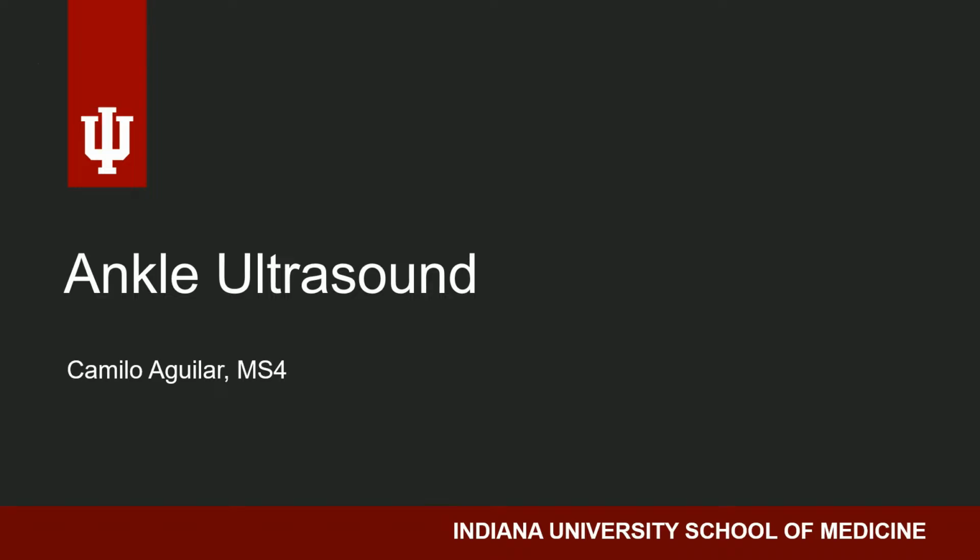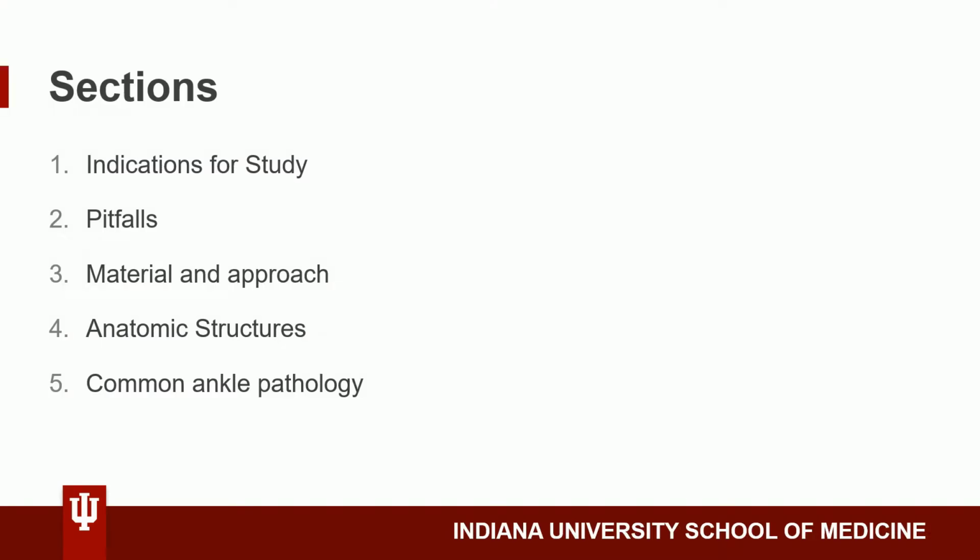In this presentation, we will be covering ankle ultrasounds. Specifically, we'll be covering indications for study, common pitfalls, material and approach, anatomic structures, and common ankle pathologies. Now, we will begin with when should we ultrasound an ankle? As you might have guessed, it can be for any injury to the ankle.